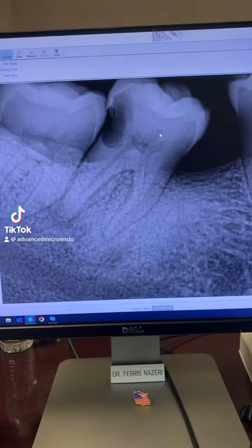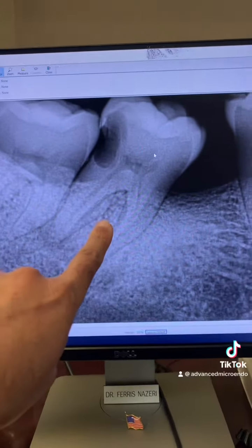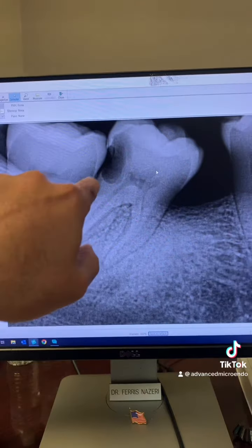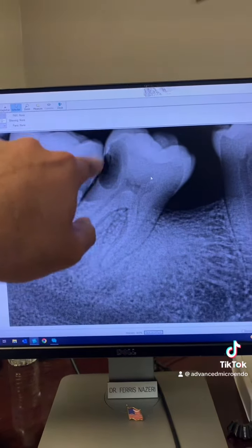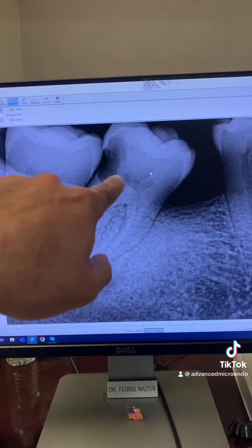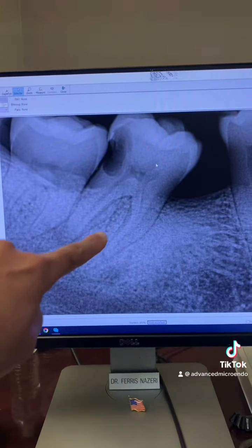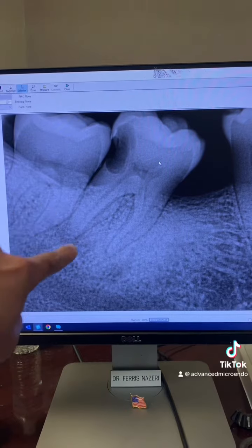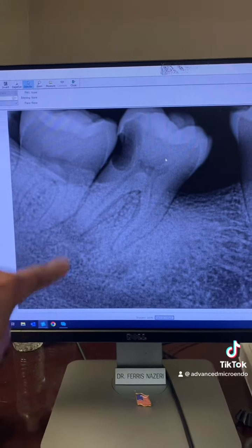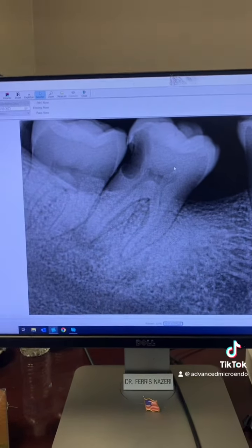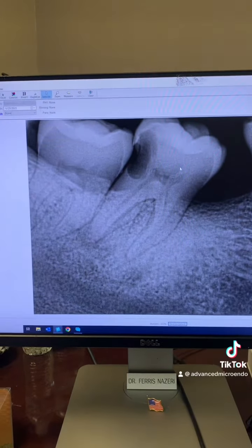This patient was referred to me for endodontic treatment of tooth number 31. As you can see, there is decay into the pulp, periapical lucency, and the patient also had a sinus tract.